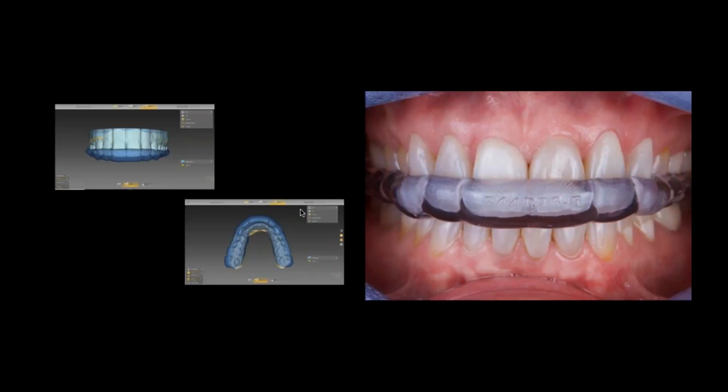And just to finish, remember that no matter how strong the material is, how good and confident we are on our adhesive cementation process, when the patient is sleeping, they are not aware, and they can affect and chip any type of restorations or natural tooth structure as well. So for us, as we are diligent on making the pre-op scan to start planning with the DSD app, and we're diligent on making that final digital impression, we immediately, after we do the delivery of the restorations, go for a final third intraoral scan of the restorations.